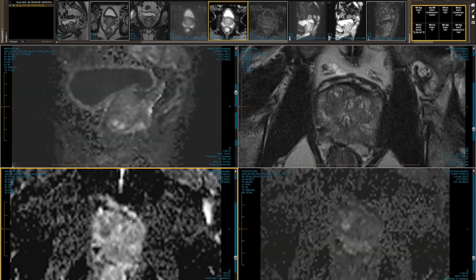They're post-radiation cases for follow-up. They are active surveillance cases for follow-up. And you can't use your PIRADS scoring for those. So for us to have a different scoring system for all of the different prostates that we look at was going to be a bit tricky.